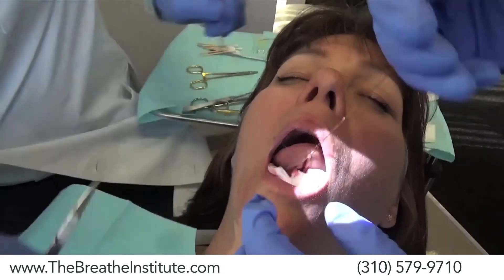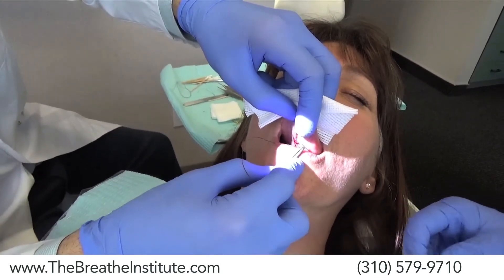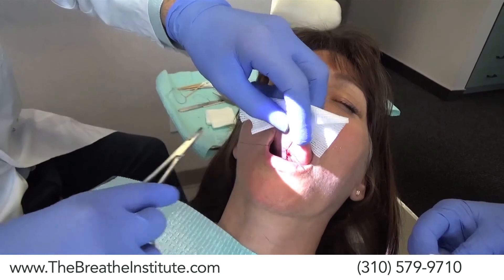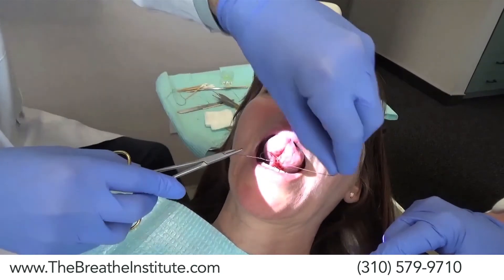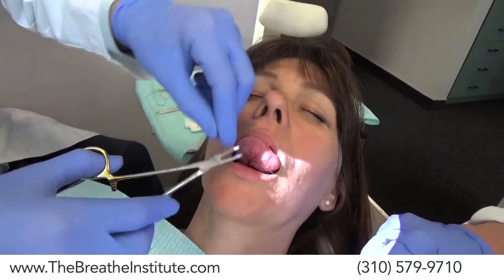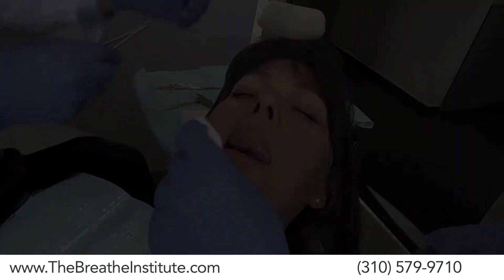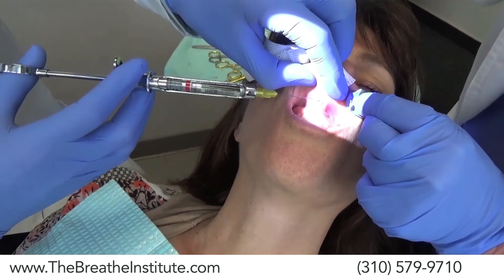This one is going to give it a lot of tension relief. After completely releasing both sides and consulting with the patient to make sure there has been a full release, Dr. Zaghi places strategic sutures to help the tongue heal together instead of from tip to base, trying to minimize shrinkage from tip to base. Now Dr. Zaghi is going to release the upper lip — deep breath in, slowly let it out.